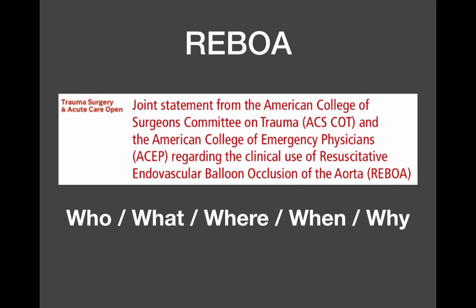AAAs, right? Because it'd be pretty nice to be able to throw an art line in, thread your REBOA catheter in, occlude the aorta, and stabilize the patient. There are some retrospective studies that have looked at patients with ruptured AAAs that these have been placed, and the data is pretty mixed at this point. So I do think there is more to come on this, but we shall see.